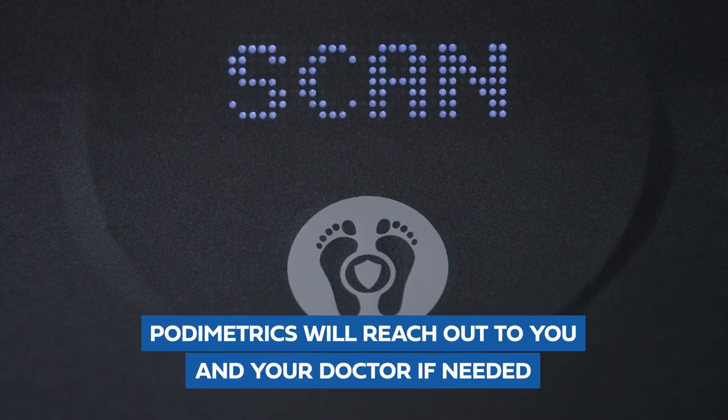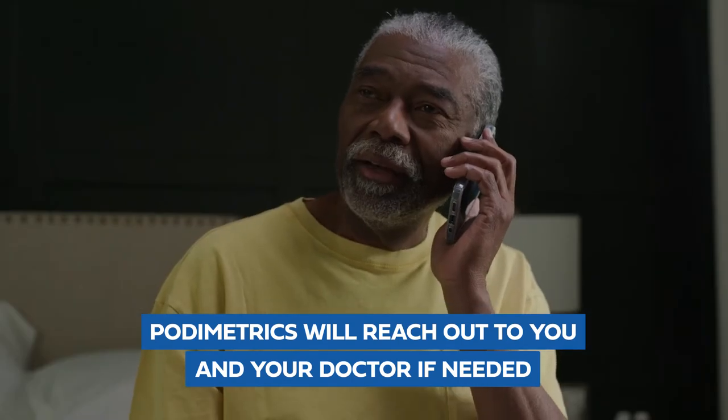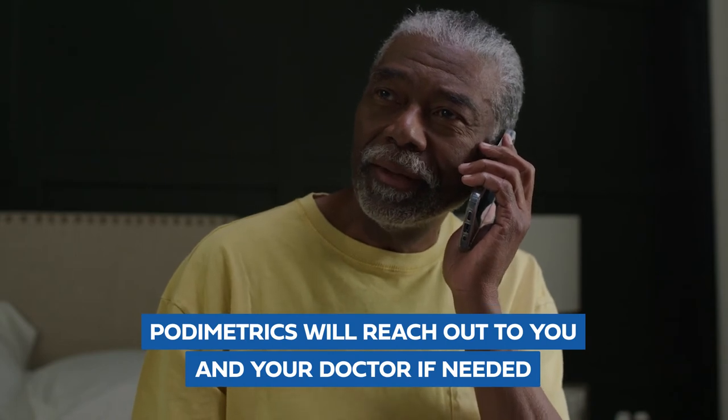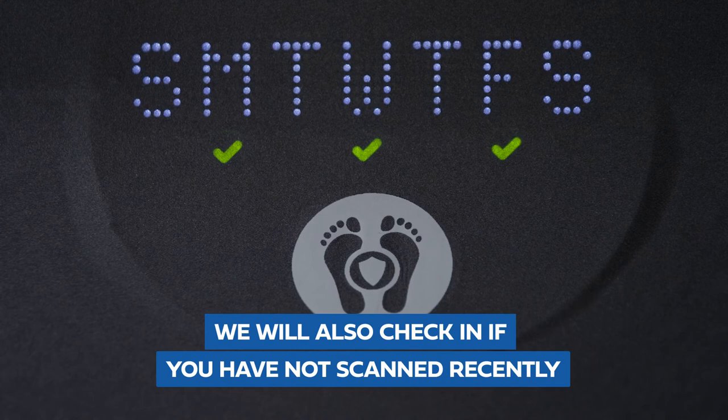If Podometrics detects any concerning temperature changes in your scans, we will reach out to you. If necessary, we'll work with your doctor to help coordinate any care you may need. We will also reach out to you if you haven't scanned for a few days, to check in and make sure your feet are doing well.